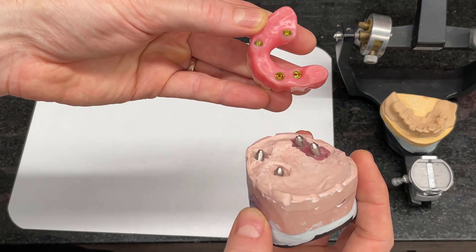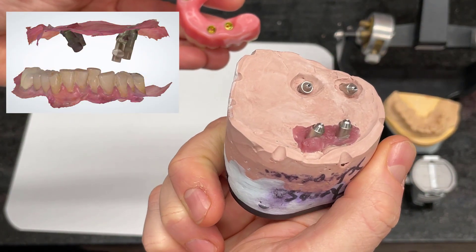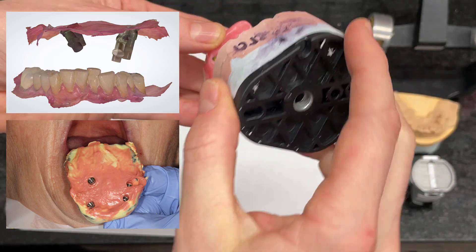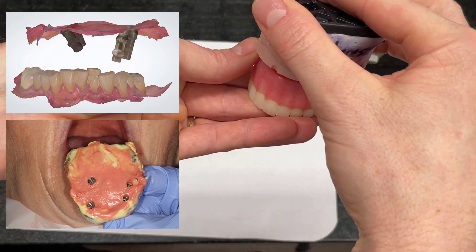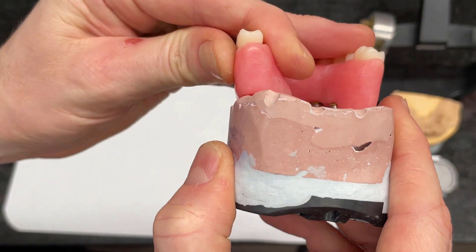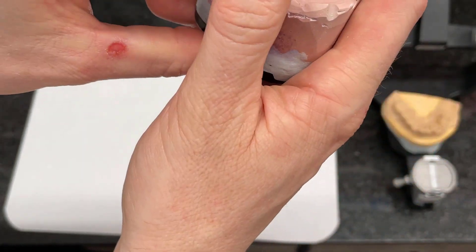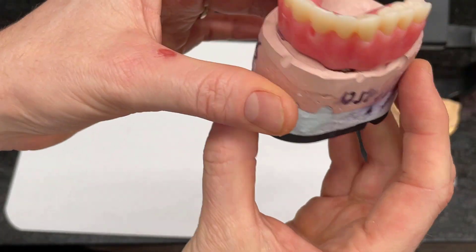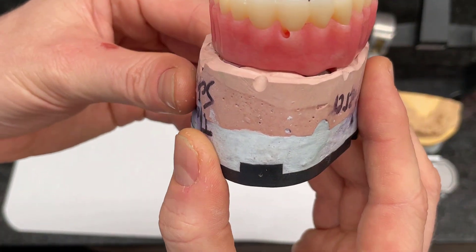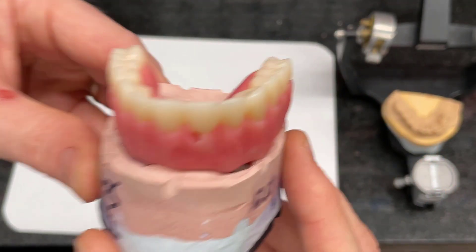Very minimal adjustments were necessary. In this particular case, I did do a digital intraoral scan as well as a conventional PVS impression, just because of the extreme angulation of the case. As you can see here, I designed it with a little bit of an opening on the lingual surface so that way it would be relatively hygienic. But this is a compromised case in an extremely challenging situation that was made fairly simple with my VHF R5 and ExoCAD.